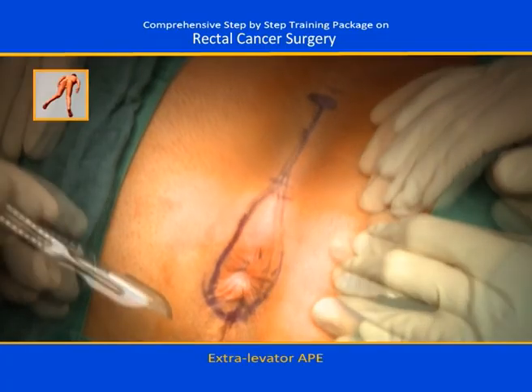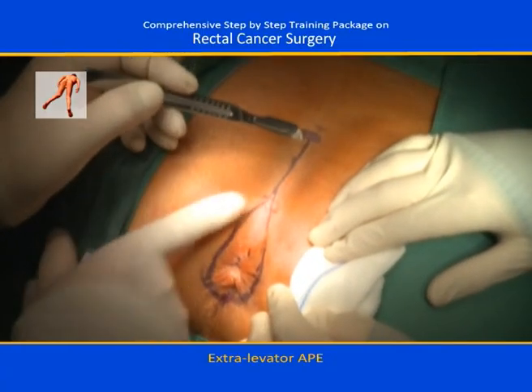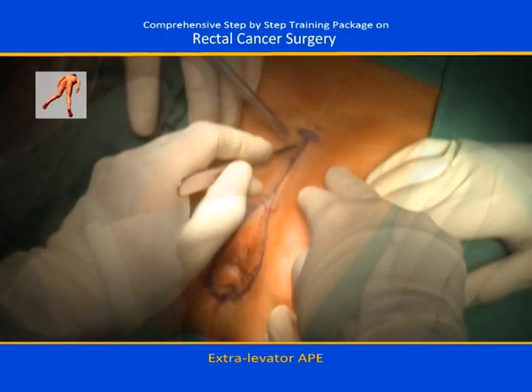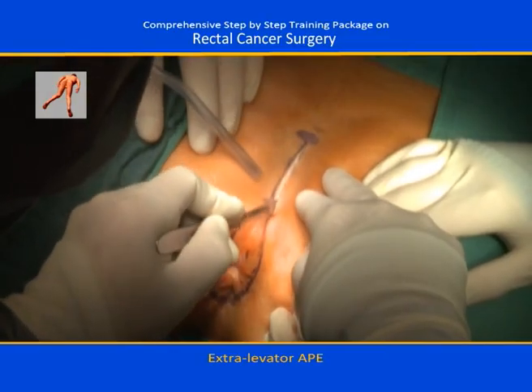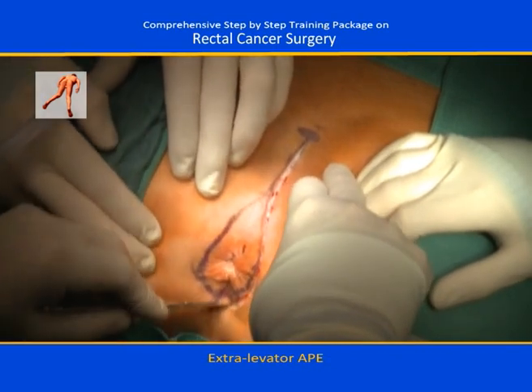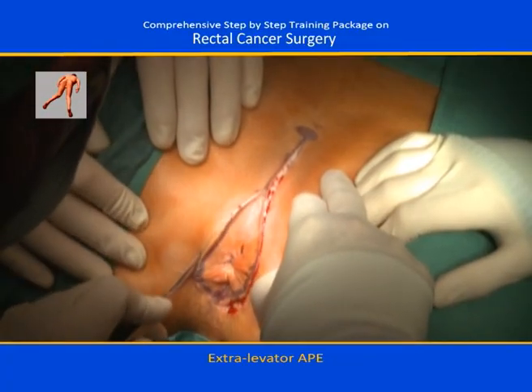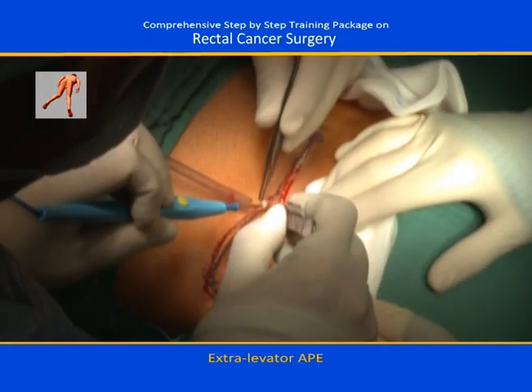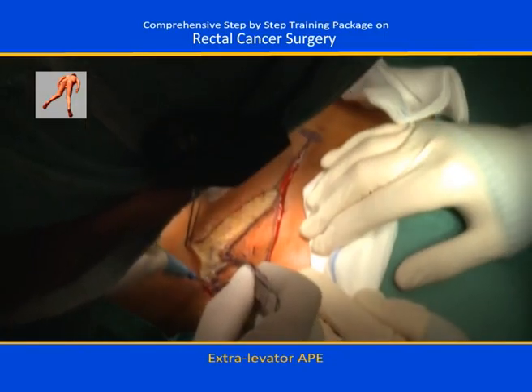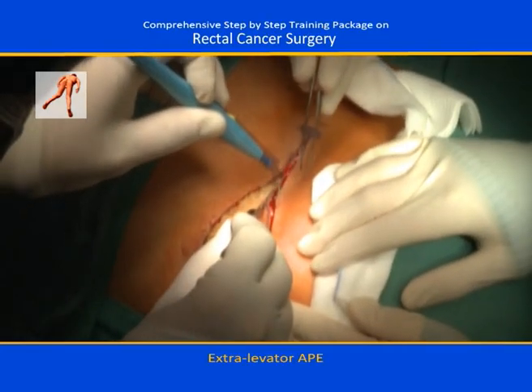Here you can see that we have marked the incision line, and here's the tip of the coccyx, and up there is the sacrum. The tumor is located on the patient's right side, close to the top of the levator. We incise in the skin around the anus, but we do not have to make a large incision in the skin. We can keep it quite small. And then, with diathermy, we dissect in the subcutaneous fat around the anus and a bit up on the sacrum, because we have to take off a bit of the sacrum in this patient.